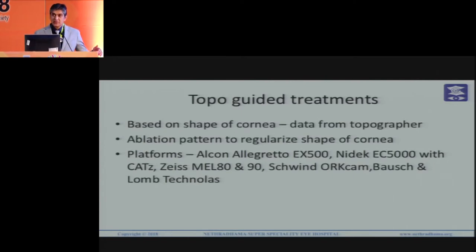The data is basically obtained from a Placido device, which gives you more of the curvature data, and Scheimpflug devices are used basically for screening.